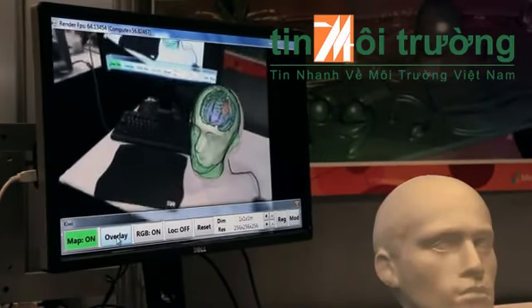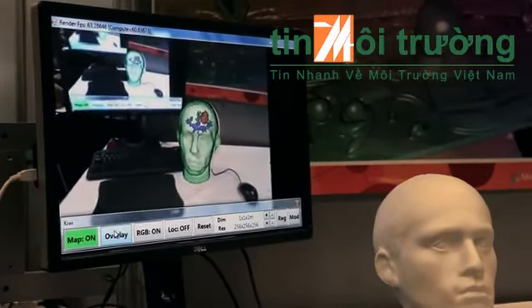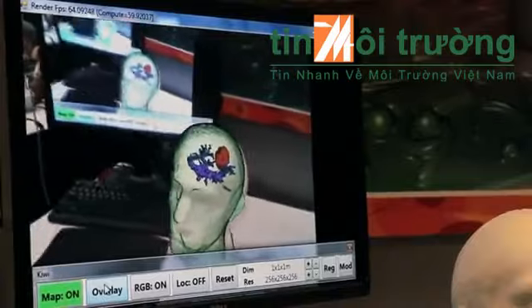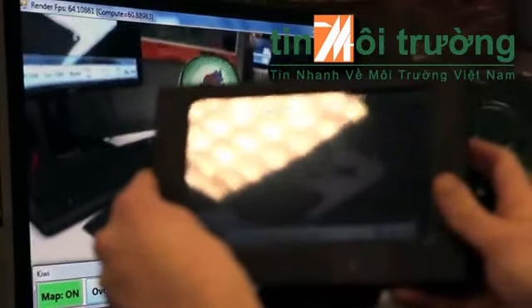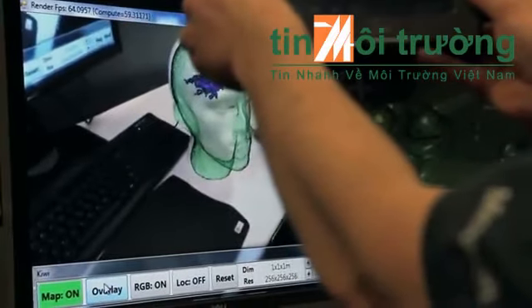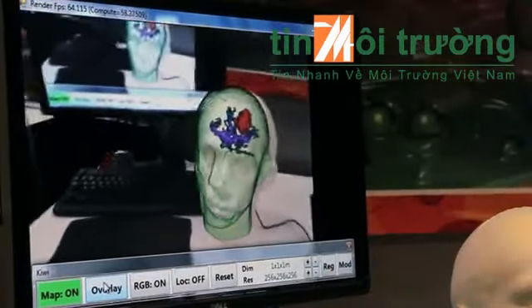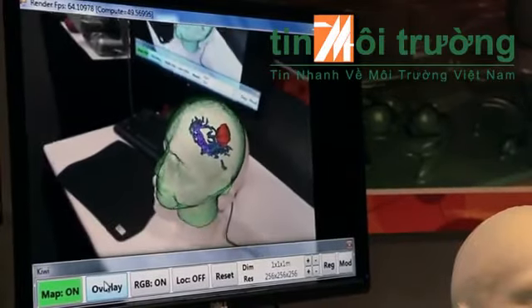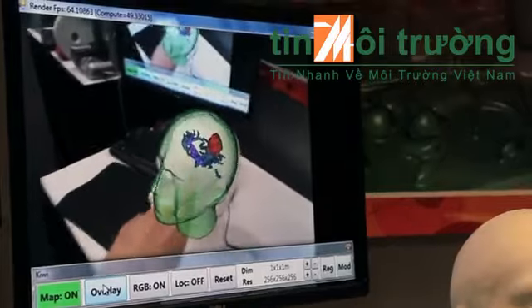And you already see this red area. This is the tumor that I want to remove. And now the physician would have the ability to walk around in the operating room and look at the patient's head from different views and basically decide what would be the best point. How do I get this red area here without destroying any important blood vessels?